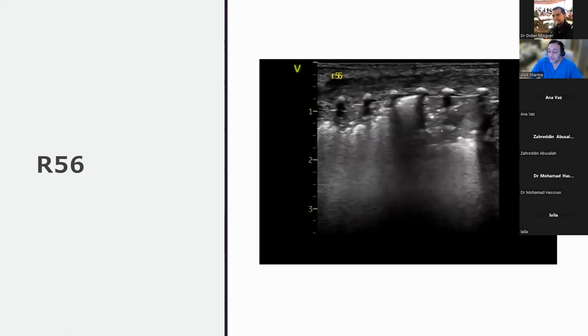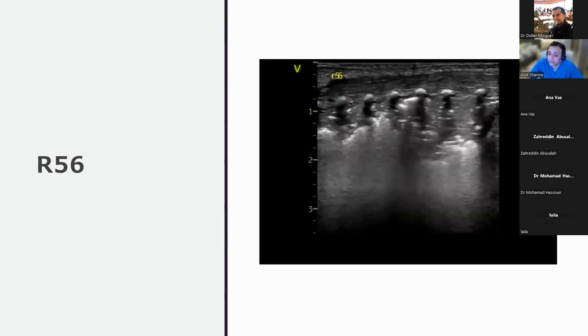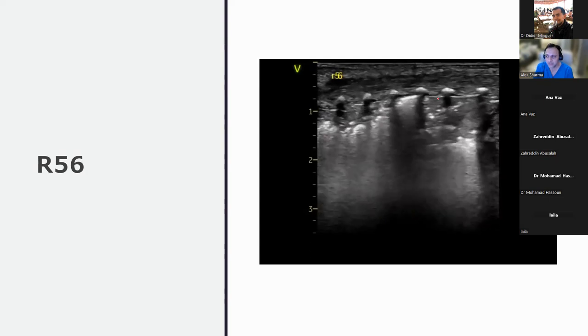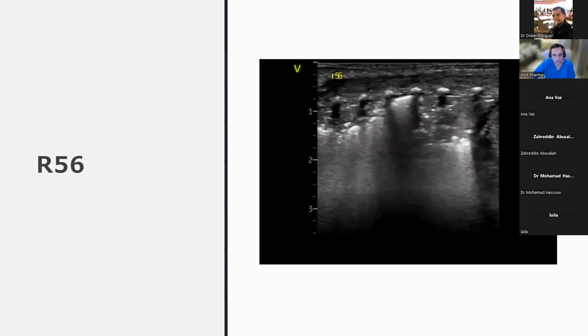So I completely agree. But somebody, Anna, I think, said that you increase the PEEP or you increase the pressure. Now, the question from your perspective is, if this resolves and this margin comes back to the end of the lung, then actually this was atelectasis. But if it doesn't improve, this is where you have to be very careful. How much pressure are you going to use to do that? This is very poorly defined in the literature, and that is where the danger arises. Because when you read the literature about how it's done, they talk about increments of PEEP by 1 to 2, theoretically done over a period of minutes.